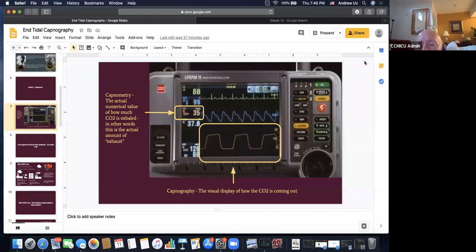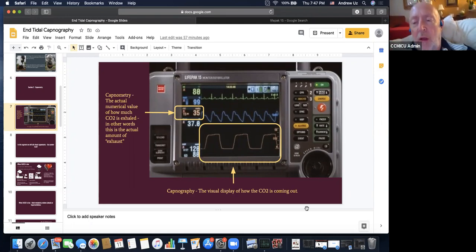By the way, you can put a non-rebreather over the top of a nasal cannula. There's no reason why you can't do both. So you can get an end-tidal CO2 onto a child that's got asthma, and you can see shark's fins. That's very useful, in the sense that it tells you you've got an asthmatic patient. Not that you probably haven't worked that out already.